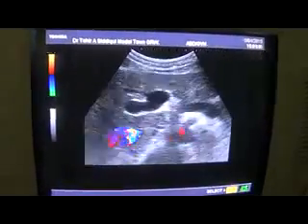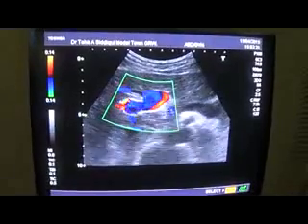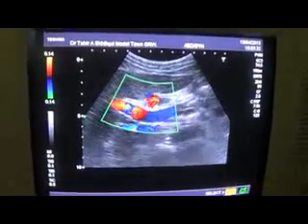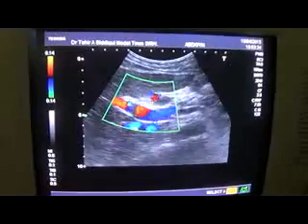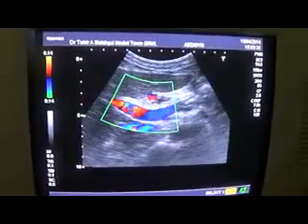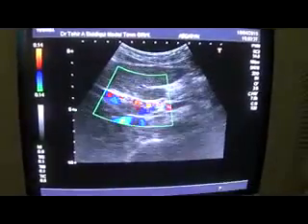Regarding the portal vein, again we will not see flow in the region of the clot.